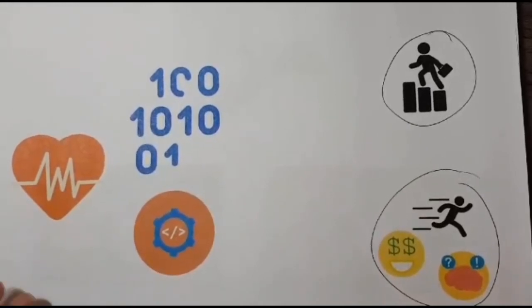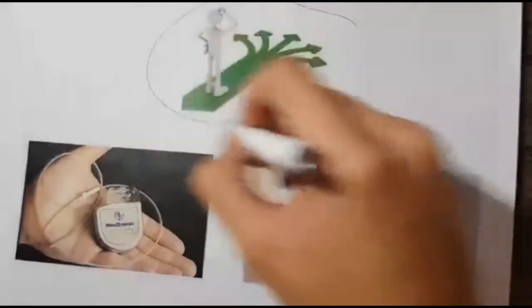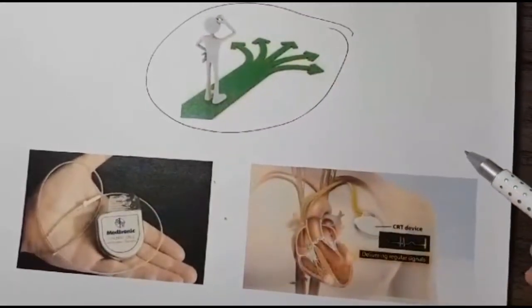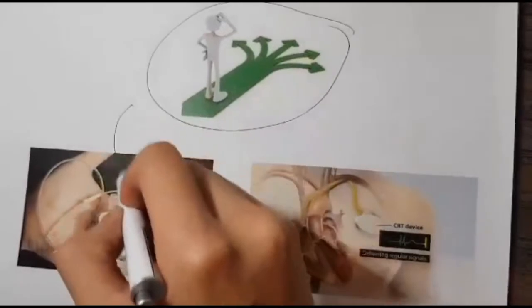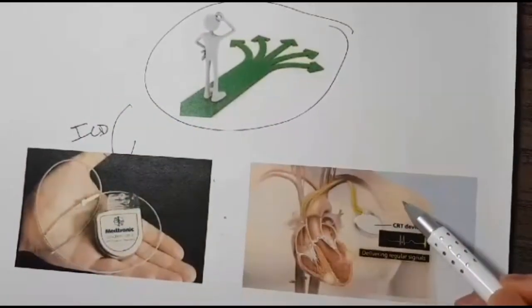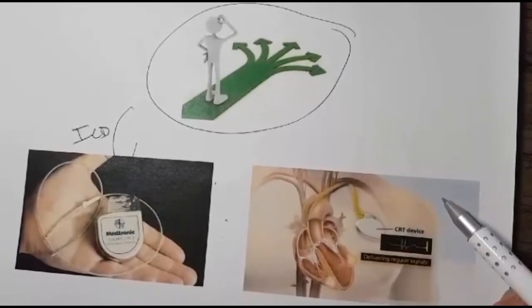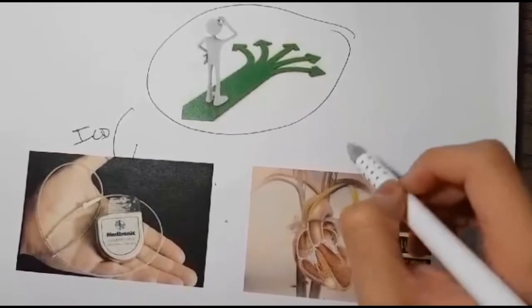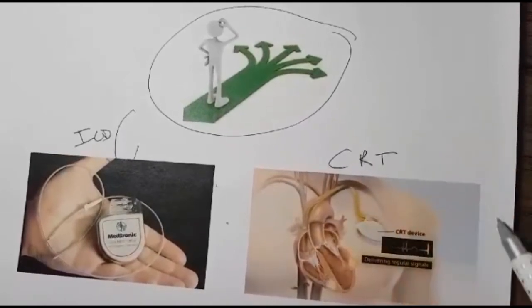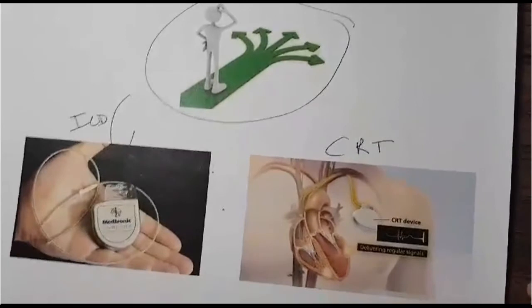There are no direct treatment equivalents to the pacemaker device. However, ICDs or implantable cardiac defibrillators are similar replacements. These devices are only recommended to patients at sudden risk of cardiac arrest or potential fatal ventricular arrhythmias, as it only sends electrical shocks to the patient if the aforementioned occurs. Furthermore, cardiac resynchronization therapy or CRTs are another related alternative to the pacemaker, though in simple terms they are just a combination of both an ICD and a pacemaker, used to resynchronize the patient's heartbeat.